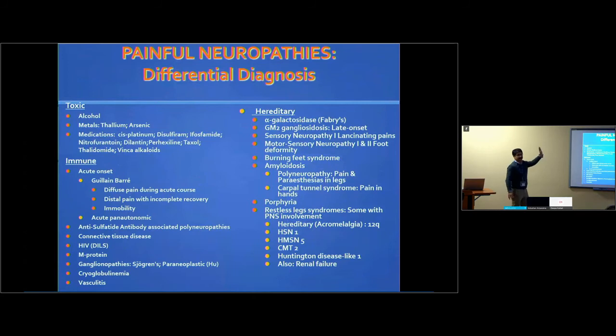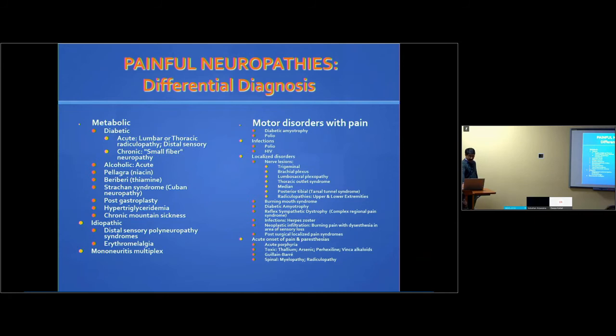And then you can go through what kind of axonal. There may be some variable. These are different types of neuropathies that, once we determine that EMG is doing it, then you try to see what is leading to a polyneuropathy. So in a painful polyneuropathy, the common causes in Canada at least would be diabetes and alcohol-induced toxic neuropathy, and the other ones are not that common.